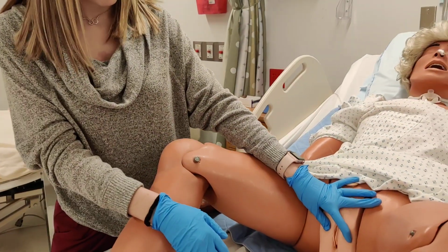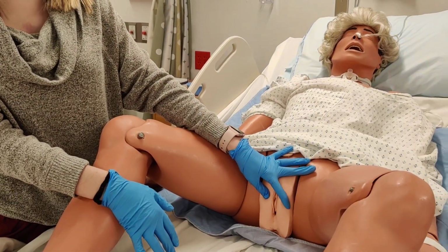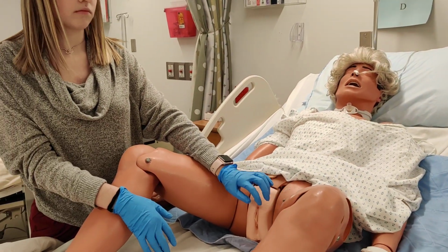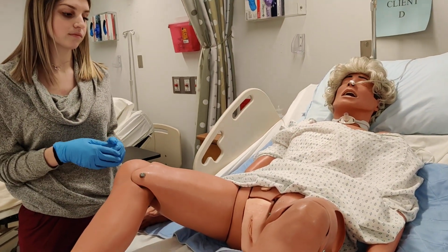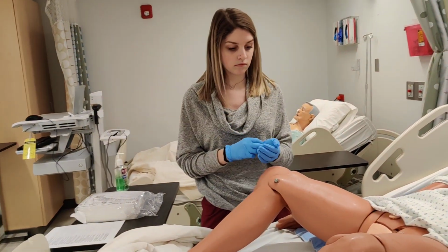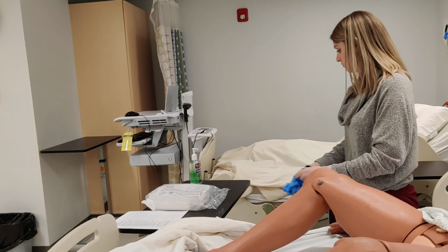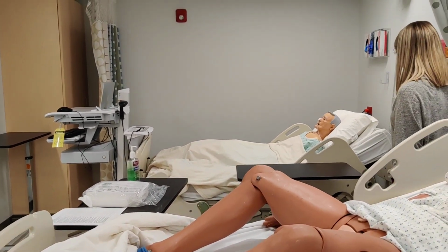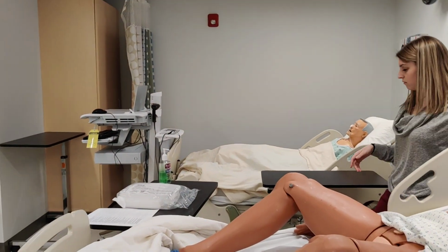Remember, everybody's anatomy is different. So one patient's meatus isn't going to be in the exact positioning as another patient's. All right, so once that's done, we're going to take off those gloves. Gabby will wash her hands, and she's going to set up her supplies.